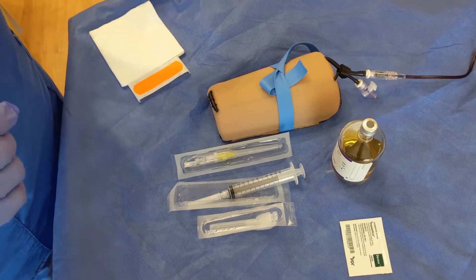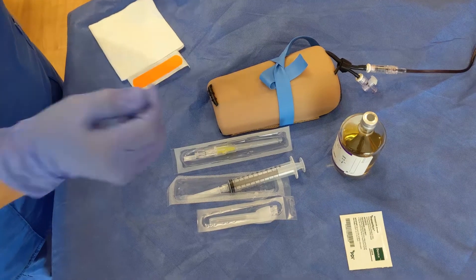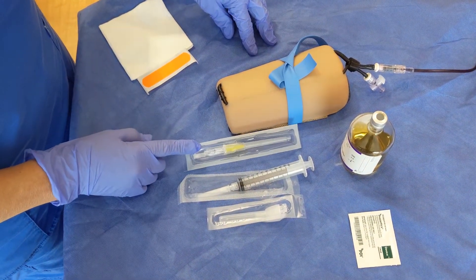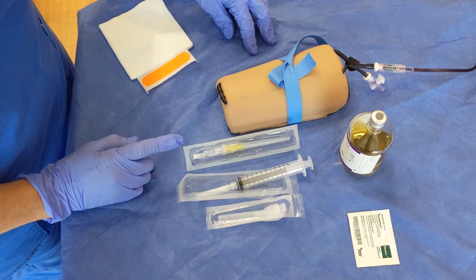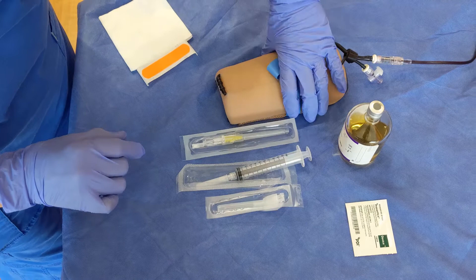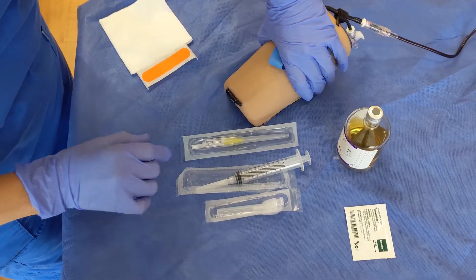This is an alternative method to obtaining a blood culture from a patient using a PIV catheter instead of a butterfly. This is helpful in very small people with very small veins.